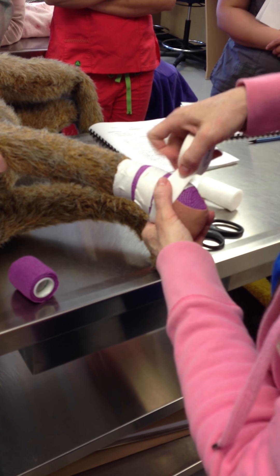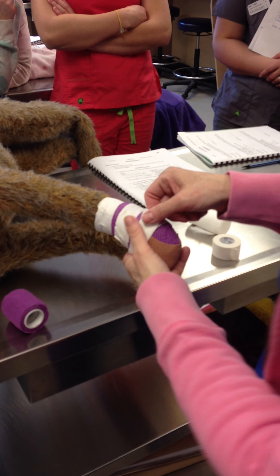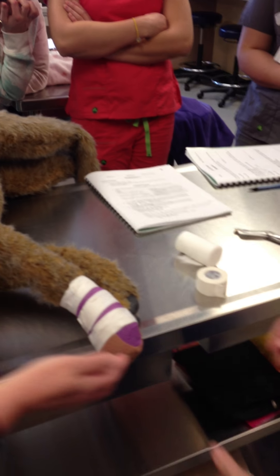I have to admit that elastoplast is not a very nice color. But we have this beautiful seasonal color to go with Easter and everything — and it's striped. It's perfect, that's beautiful.